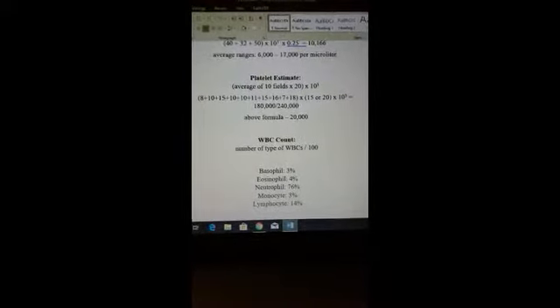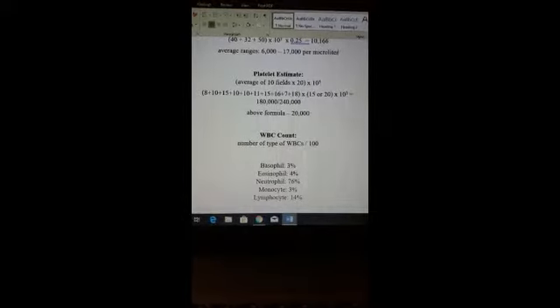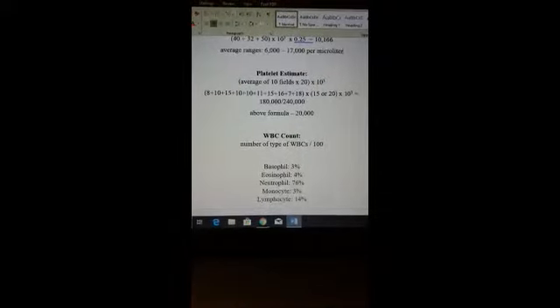So we took the average of our 10 fields. We got an 8, a 10, 15, a 10, a 10, an 11, a 15, 16, 7, and 18. We added all of those up, divided them by 10, and got the average of 12. Then we multiplied it first by 15, and then multiplied that by 10 to the third power. This is another reason why it's good to rewrite everything down and double check your math, because we missed a 0 while we were scribbling things down and punching it into our calculator.